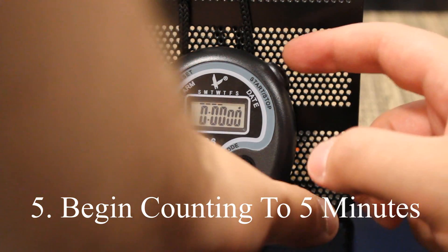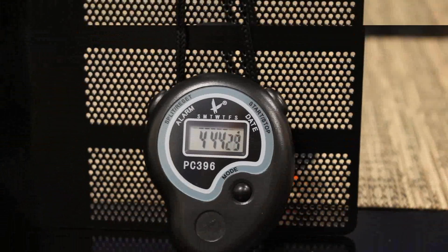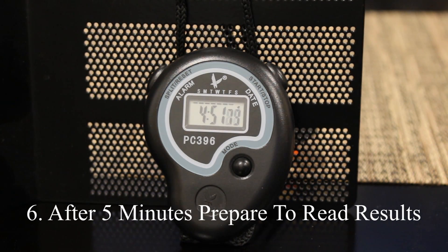Step five: begin counting to five minutes. Step six: after five minutes, prepare to read the results.